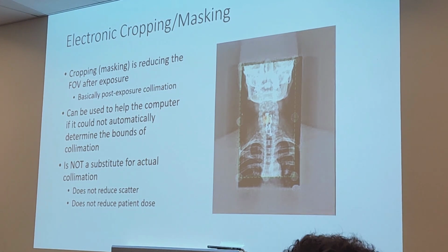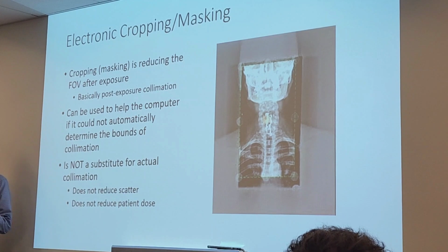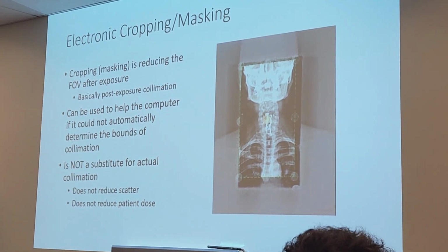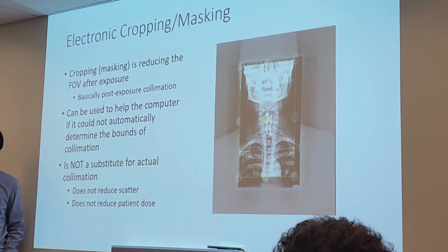Does their computer have its own form of rescaling then? It's not that it has its own form of rescaling, it's just that due to the standards those monitors have to meet, images will look different. And is that only pertaining to windowing and leveling, or is it any post-processing? Any post-processing can cause loss of data.